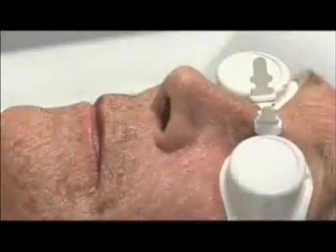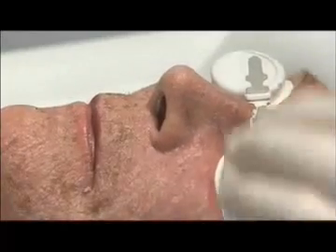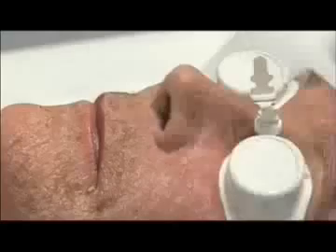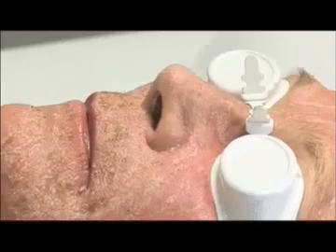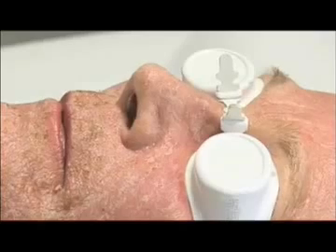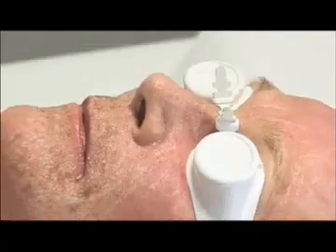We've nearly finished, and we are going to rapidly sweep over the entire face again in order to get rid of the gridding effect of the first passage and to create a harmonious effect. But we will decrease the power, therefore I'm increasing the size of the impacts back up to 6 millimeter squares, and I'm decreasing the power.